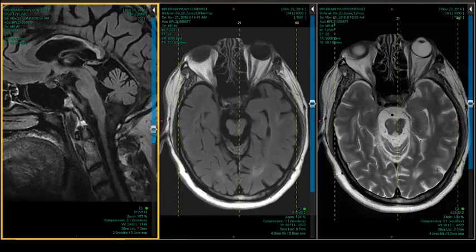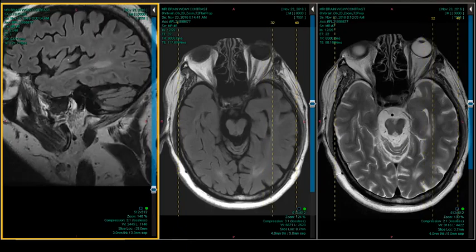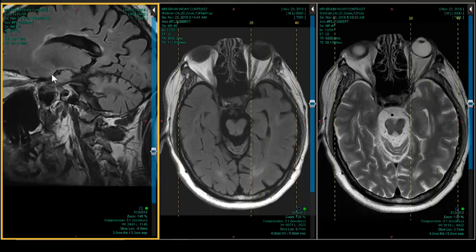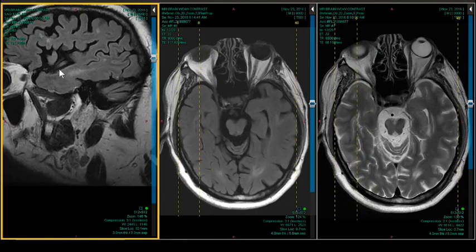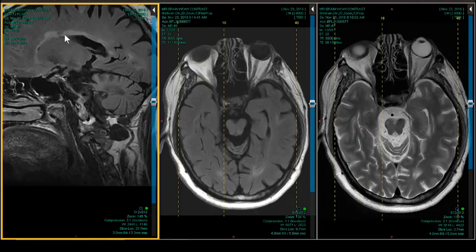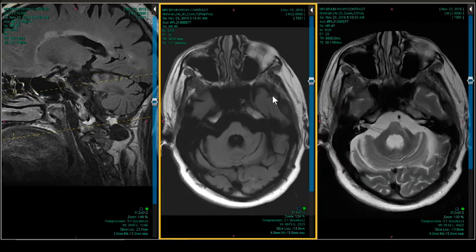Let's take a look at the temporal lobe. I mean, it's going to be atrophic, but does it have that knife blade pattern of atrophy? Well, maybe a little bit. Maybe it does. It does. But it certainly doesn't explain this corpus callosum. And it doesn't explain the brainstem and posterior fossa atrophy. Remember our frontal lobar dementia, how decent the posterior fossa looked. So that takes us out of that diagnosis.